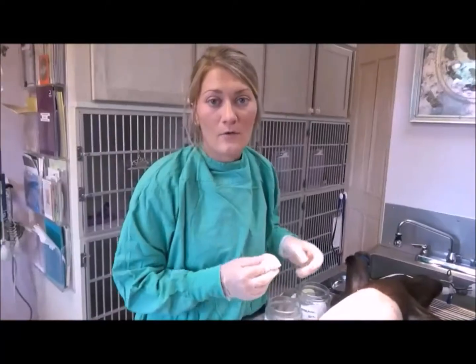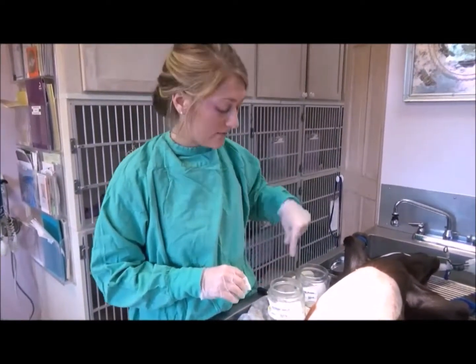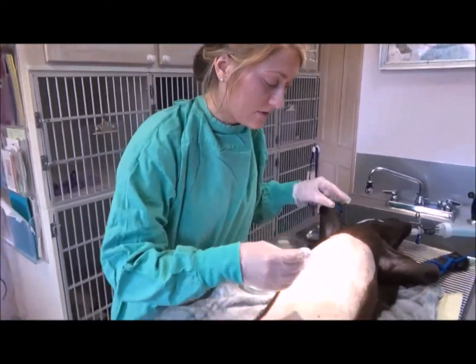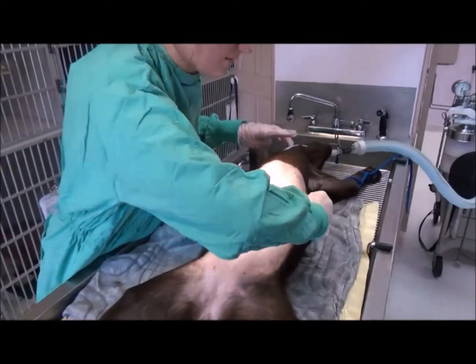That looks good. Now I'm going to be doing a non-sterile prep of our canine spay patient. I'm going to be using 2% chlorhexidine scrub followed by 70% isopropyl alcohol rinse. The first thing I'm going to do though is take alcohol and rub the hair down along the edges just to keep the hair moistened and down.